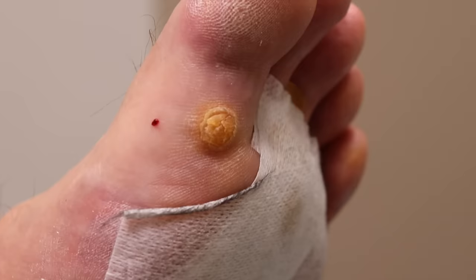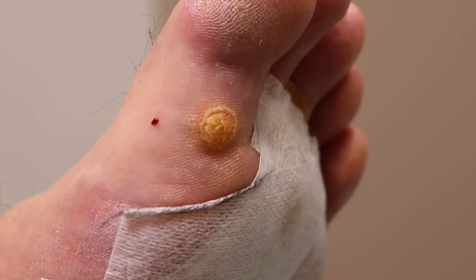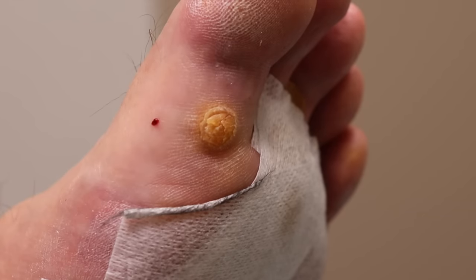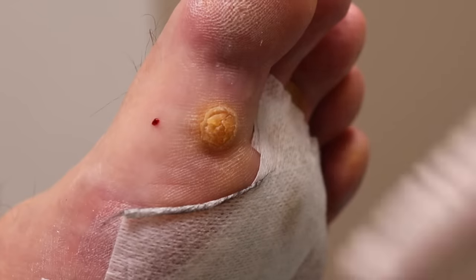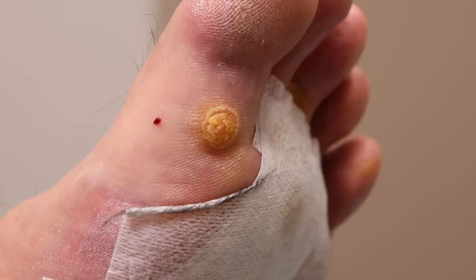This one is much larger. Normally if it's on the toe, I just do an easy tourniquet right on the toe. If it's on the bottom of the foot, I'll use an ankle tourniquet. You've got me stuck right in the middle trying to figure out how to apply a tourniquet. The reason is warts bleed like crazy because of all those little black dots — the blood supply that's feeding the wart. If there's too much blood, I can't see properly, and I want to make sure I get everything out.